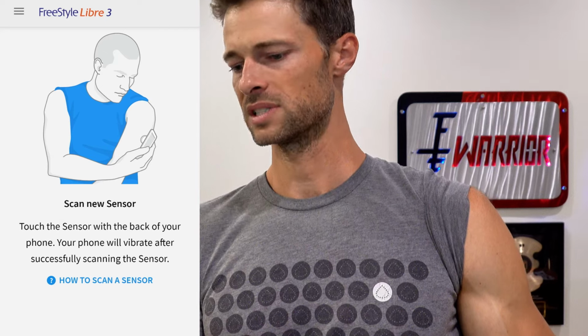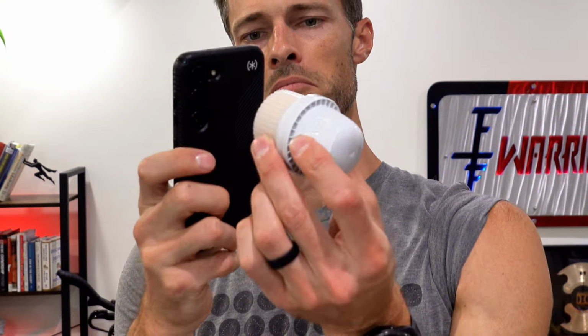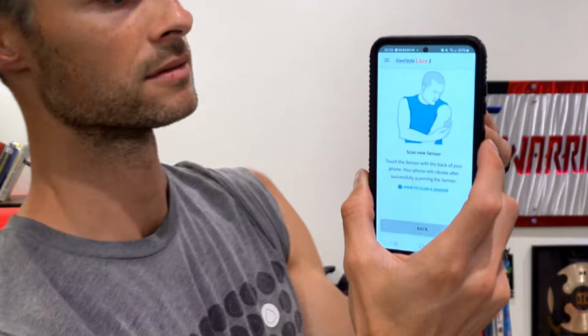Scan the new sensor. Oh, that's right, Freestyle Libre 3 is a scan. Touch the sensor to the back of your phone. Let's see if it works together.